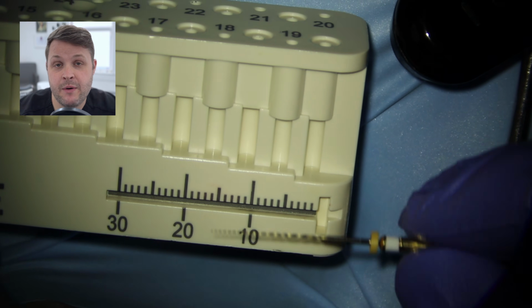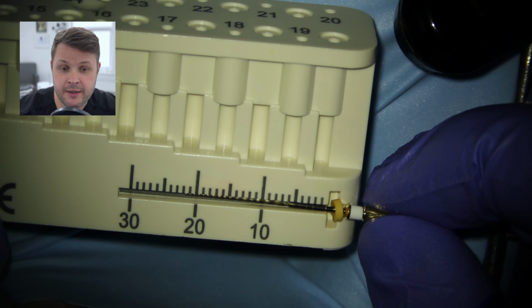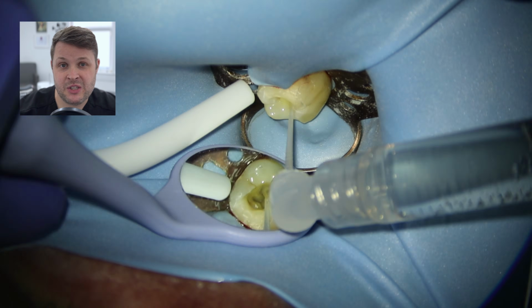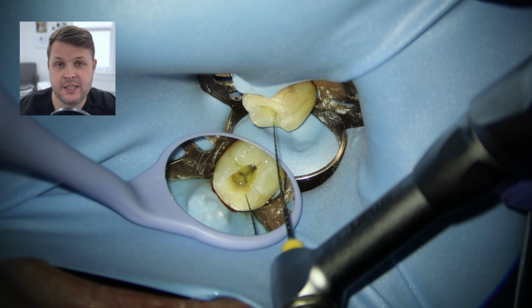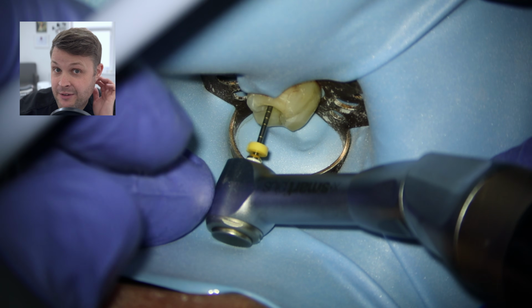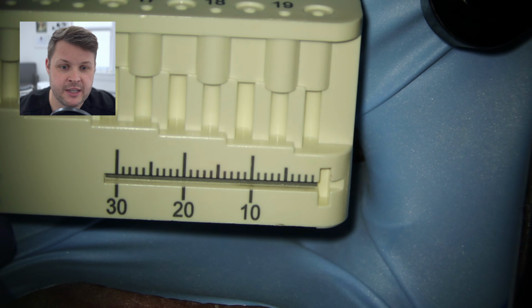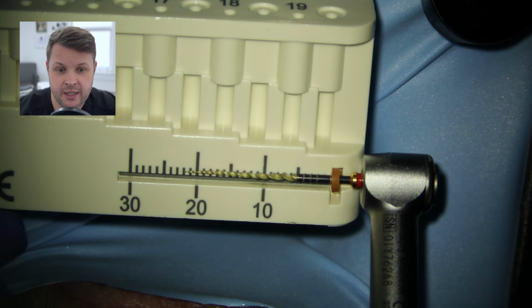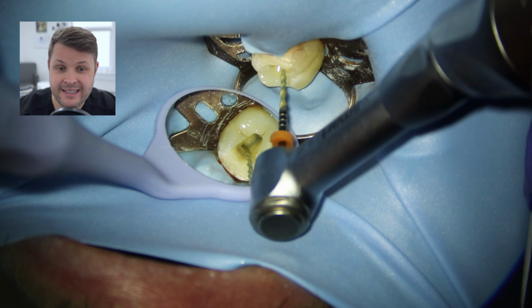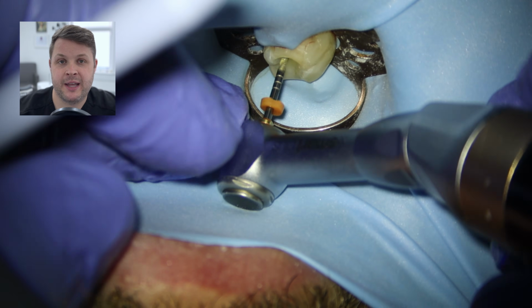We're then going to take our 1503 high flex glide path file, measure it at 23, and try and shape out the canal that's been successfully negotiated. We're going to open up this canal space, and usually when you can't get down a canal space, it's because the file is getting gripped further up its shank rather than at the tip. Then I'm going to use a size 25 variable taper, a thicker file, minus 1 millimeter from the furthest point we've reached, and really open up that canal space.